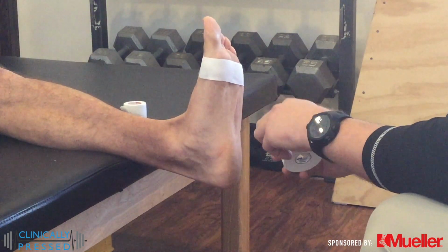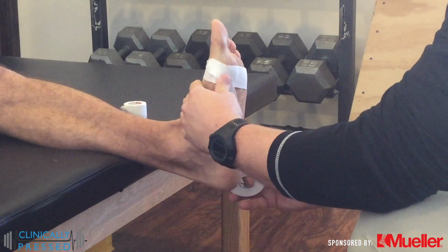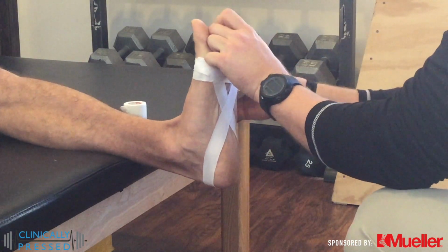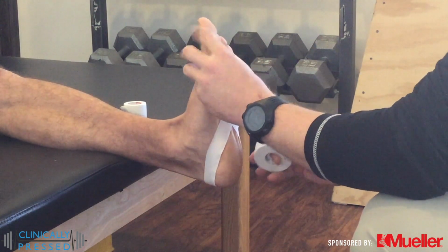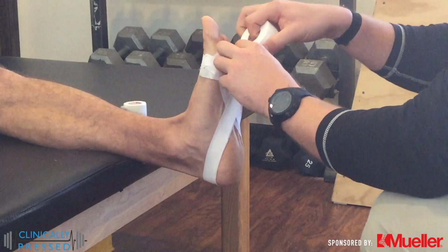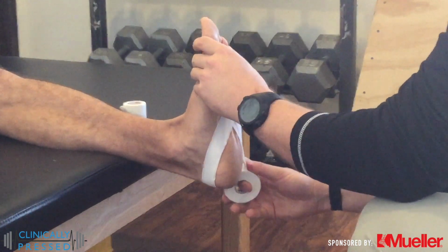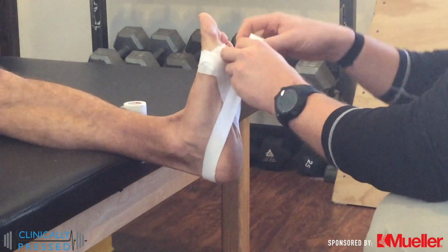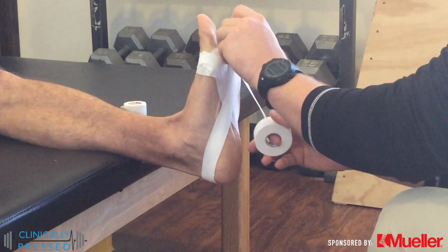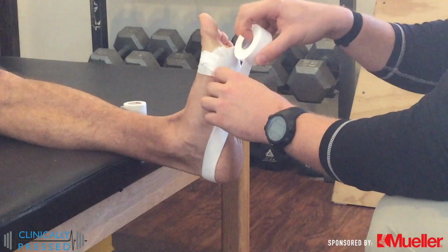From there, we're going to do the teardrop procedure first. We're going to use either a 1-inch roll, or you can split a 1.5-inch roll in order to get the size that you want. We're going to work medial, going off the different points, the ends of the metatarsals, bringing it around, working as far lateral, and then start working our way in. We're basically trying to make a teardrop right around the calcaneus to support that plantar fascia and the intrinsic muscles of the foot as we're moving through with those.